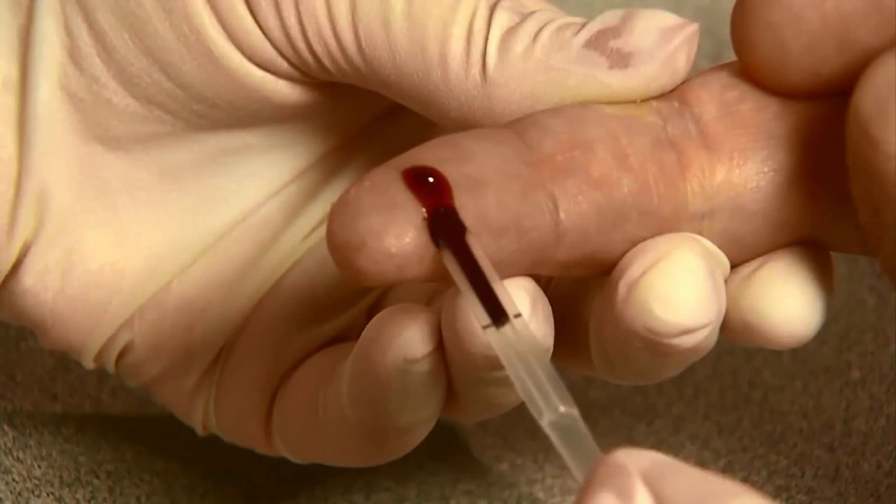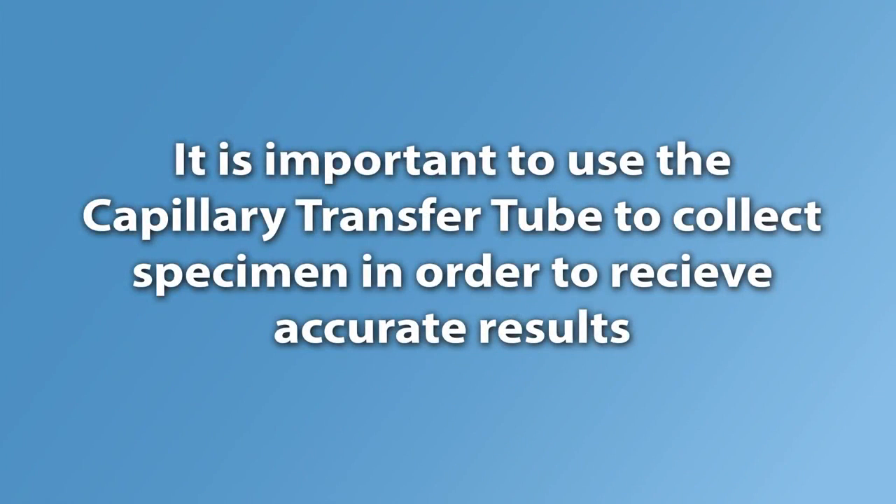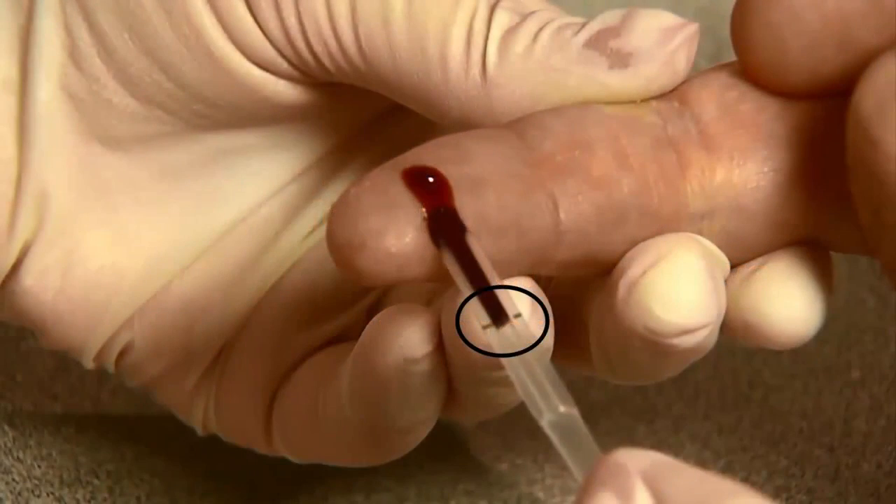The capillary transfer tube will fill automatically. It is important to use the capillary transfer tube to collect specimen in order to receive accurate results. Make sure the blood covers the air vent of the tube or it will be difficult to squeeze the blood out. Never squeeze the capillary transfer tube while sampling.